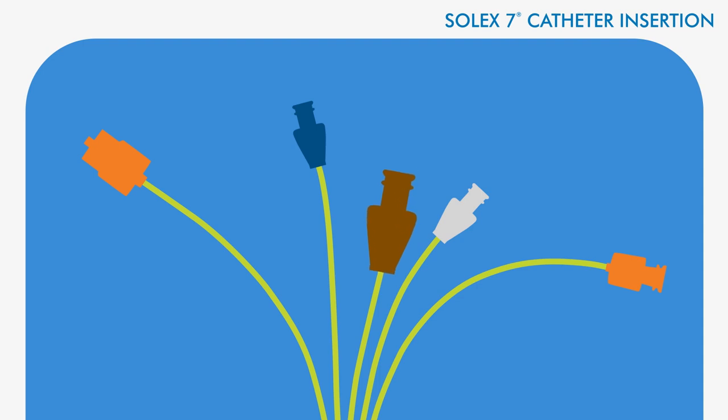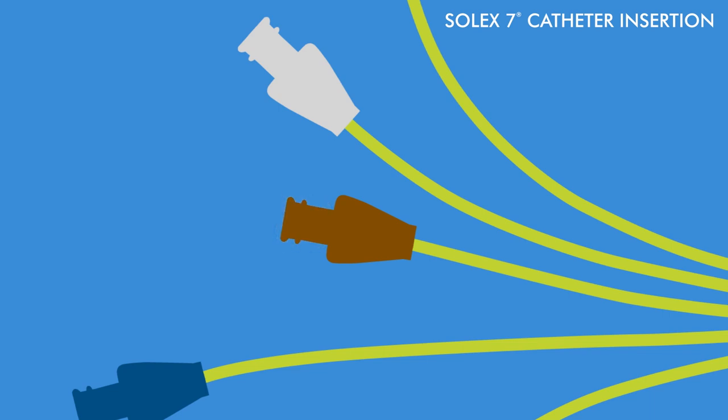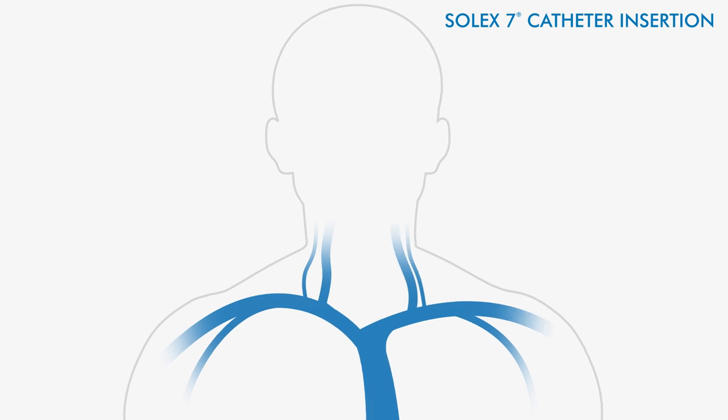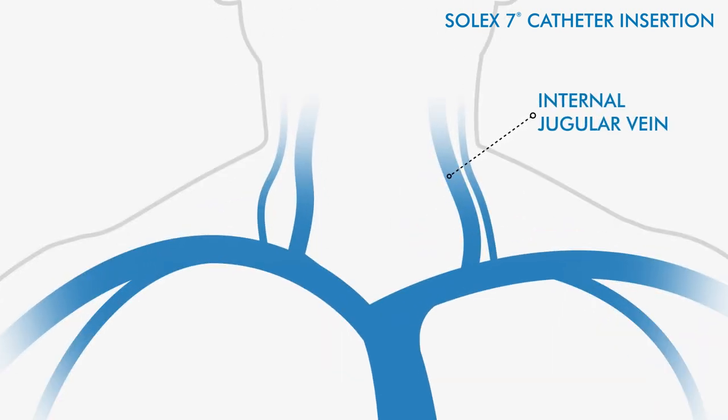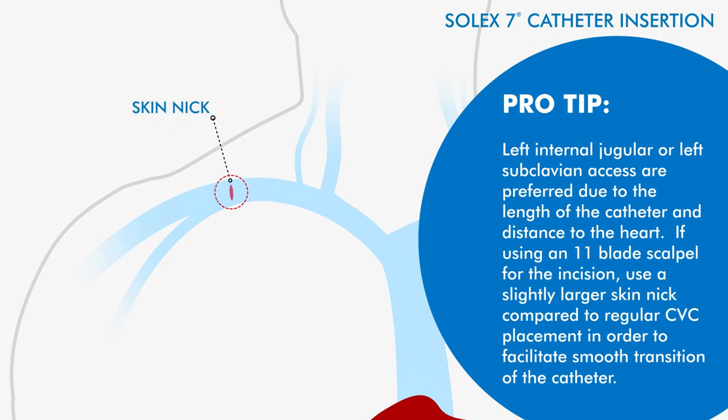Flush each of the distal, medial, and proximal lumens with sterile saline. Leave the distal lumen uncapped for guide wire passage. Select a venous access site, either the internal jugular vein or subclavian vein, and obtain access per standard percutaneous technique.